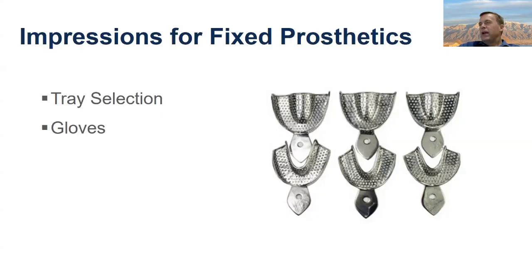I love these metal trays. I know they're a pain to sterilize. Not too many people use them anymore, but you want to talk about a foundation. There's a sturdy foundation for an impression right there.